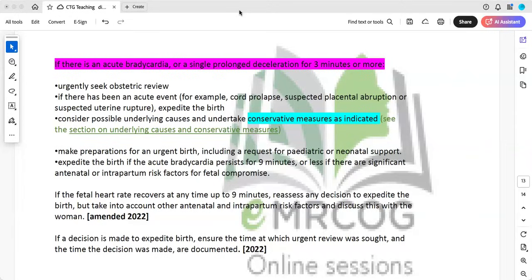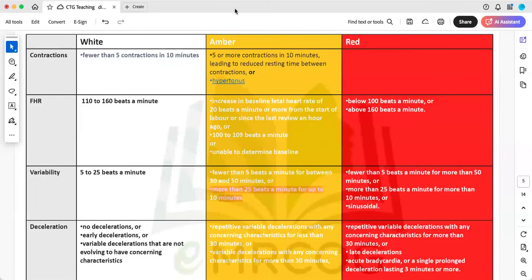My friends, I hope that today I've clarified for you some of the concepts regarding the CTG. Of course, you need practice and application of these principles and this table for CTG cases. You can start from your workplace and the cases that you see in daily life in the labor ward, and participate in decision making using the latest update of the NICE guideline.